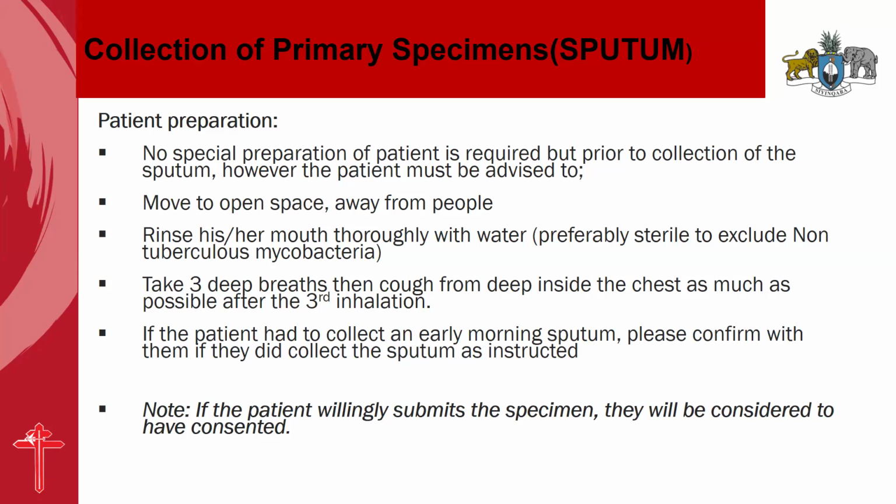If the patient had to collect an early morning sputum, we have to confirm with them if they did collect the sputum as instructed. Sometimes you give them the containers to go with them at home, then they do the collection. So you have to give the instructions as clearly as possible.